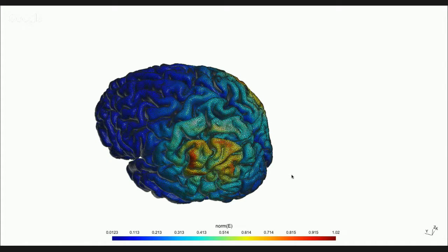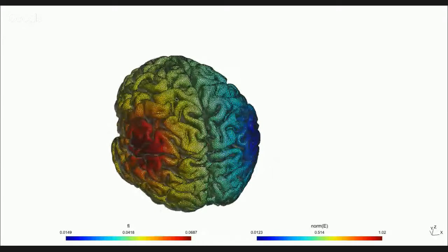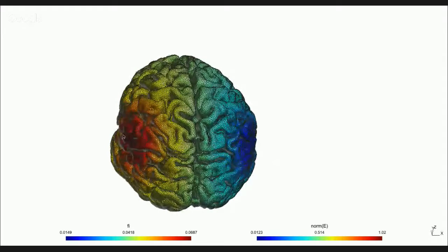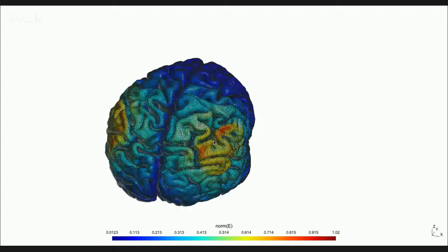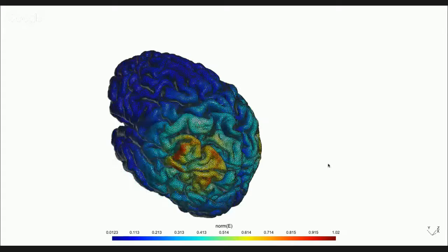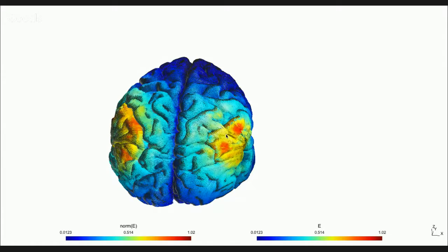So yeah, that was an example for TDCS. For example, if the anode was somewhere close on the skin here on that side and the cathode here, that's the potential, right? So positive to negative. And then the electric field kind of looks like this. You have high electric fields close to the electrodes. What is also very common is that near the edges of the electrodes, looking in the direction of the other electrode, you get the highest electric fields because they have the steepest drop-off in the voltage. So yeah, the electric field is of course a vector quantity, so it's a little arrow.